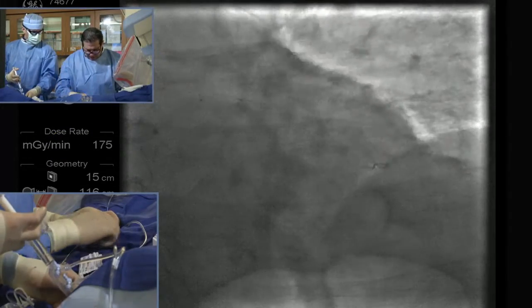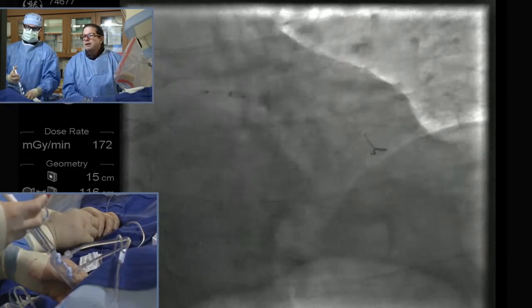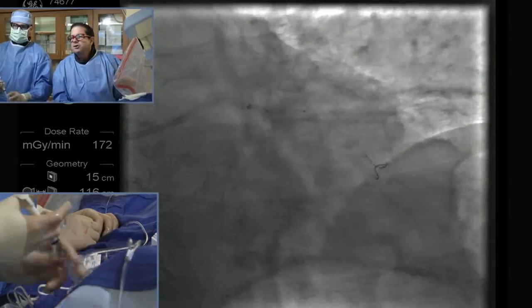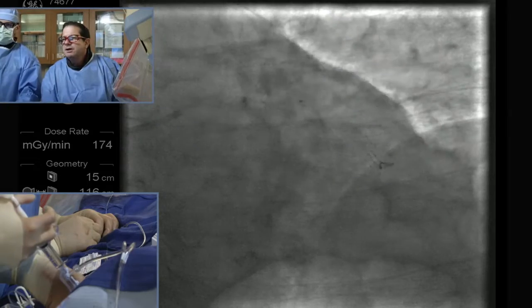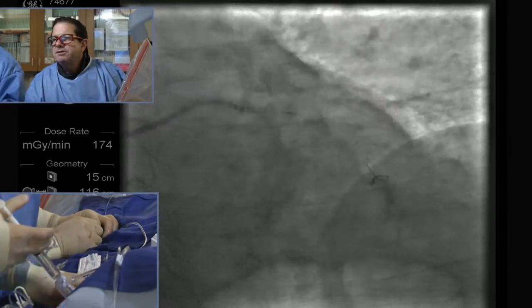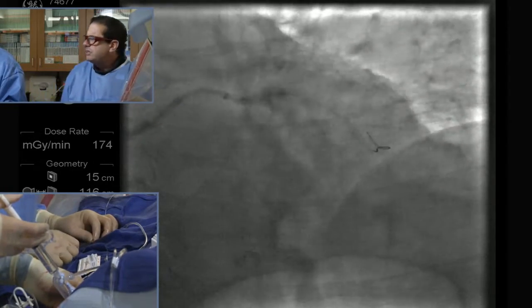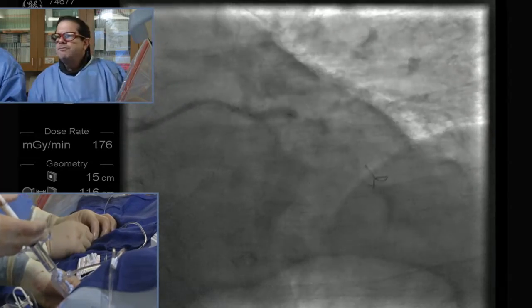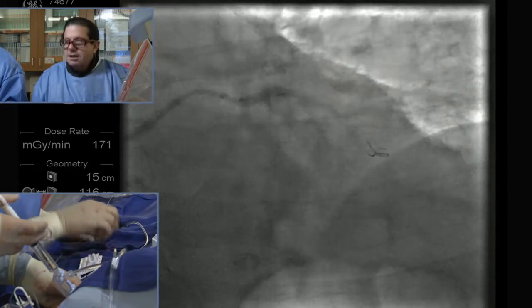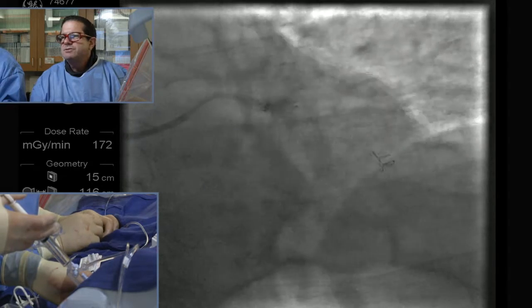Let's take the guidezilla here and do an easy test. Let's take the balloon up: 10, 12, 14 — was this NC or not? No — 16. Now come on down. We'll just put some steady pressure on this as the balloon goes down and see where it goes.